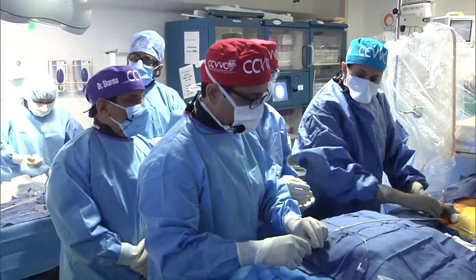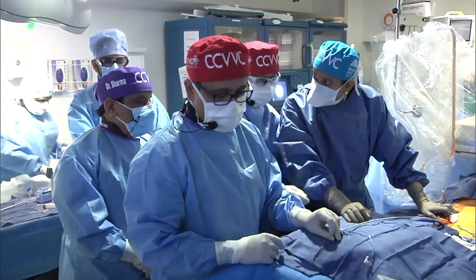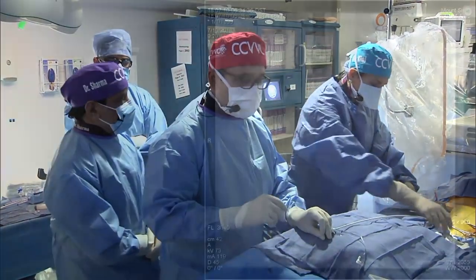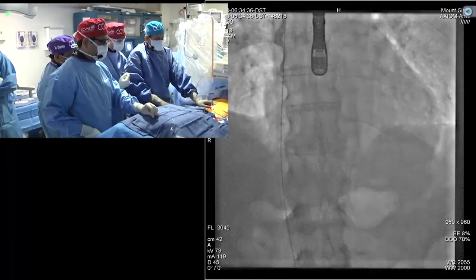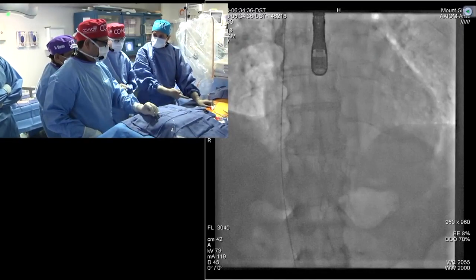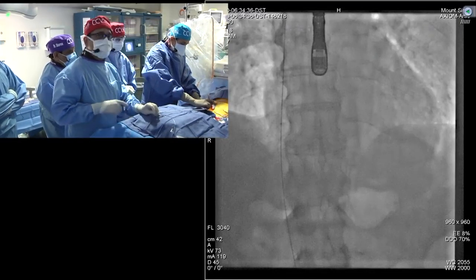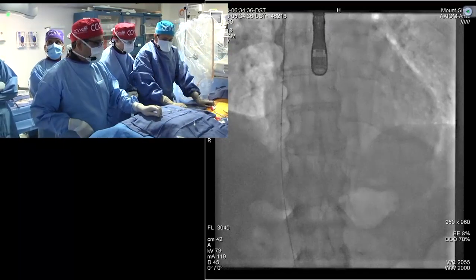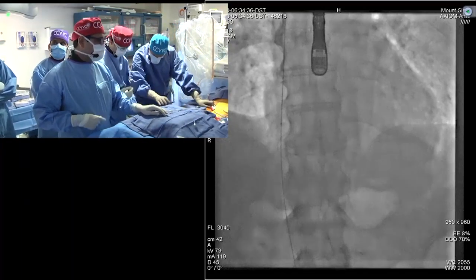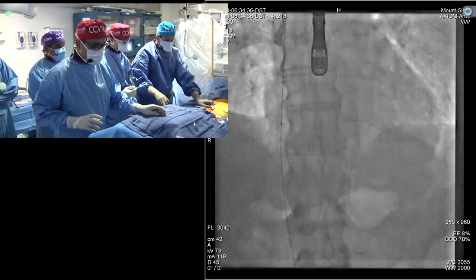And now based on this, let's ask Asad, also our young, budding structural interventionalist. Groin access means the vein, figure of 8, and the pre-close. Tell us, Asad. Different strategies are used for pre-closing the vein. We have adopted a 2 pre-close strategy, and we also do a figure of 8 suture just as a precautionary measure.